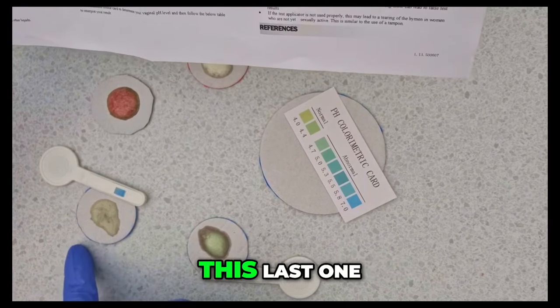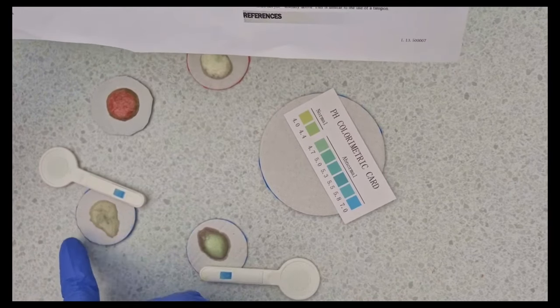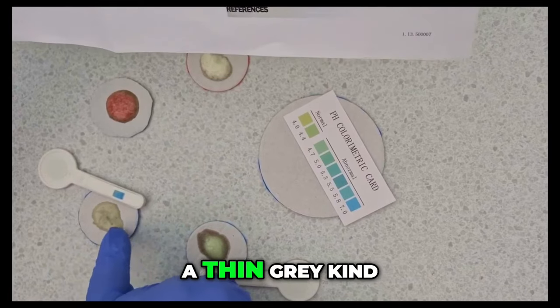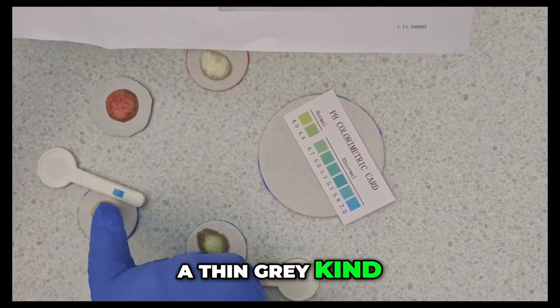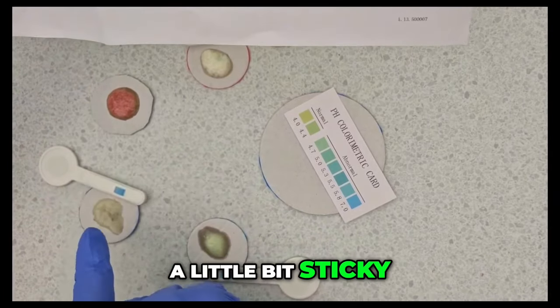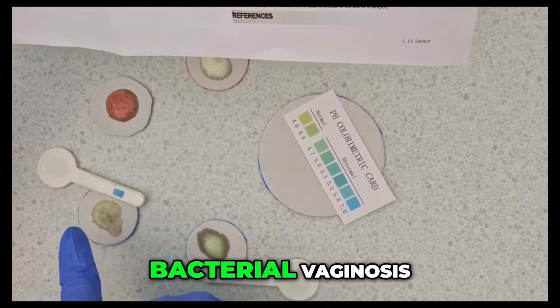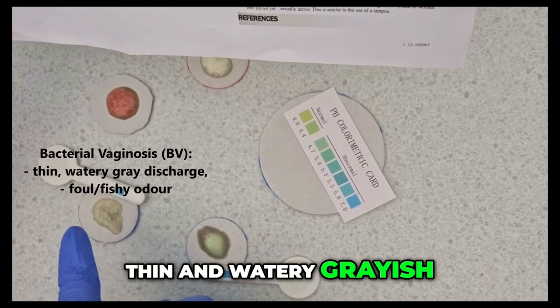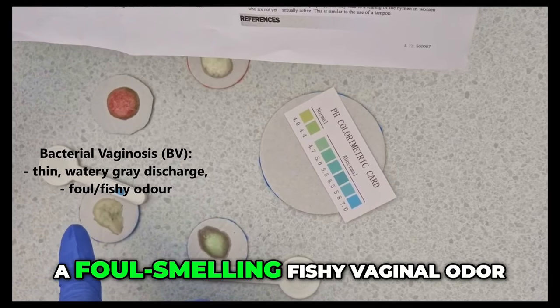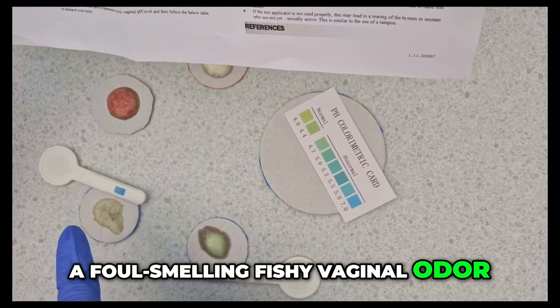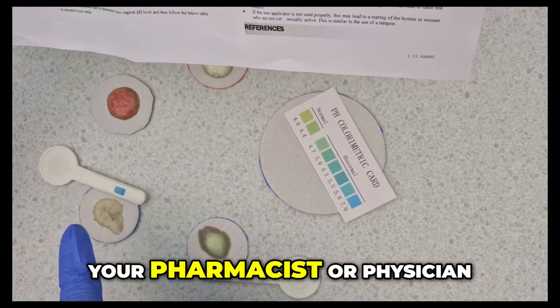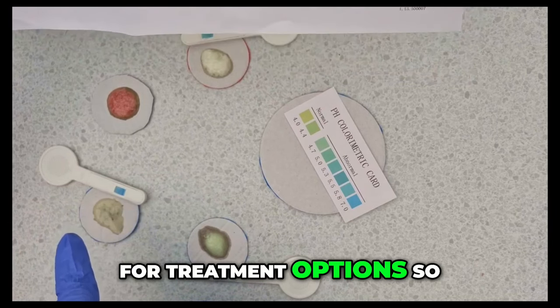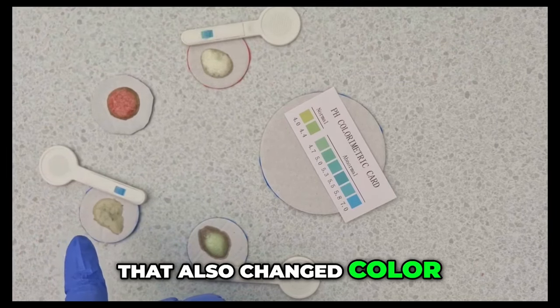And let's look at this last one. So this last one is kind of like a thin grey sort of grey kind of discharge. A little bit sticky. But this one is bacterial vaginosis. Thin and watery greyish white vaginal discharge with the foul smelling fishy vaginal odor. And that's BV. Speak to your pharmacist or physician for treatment options. So that also changed color.